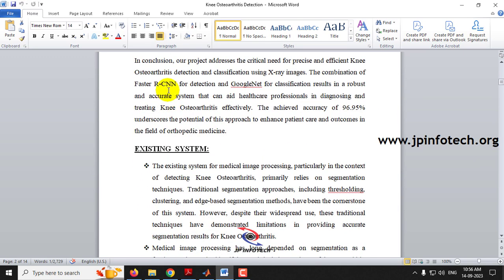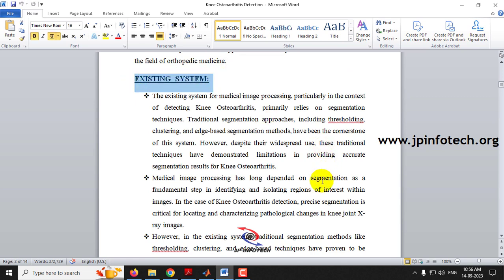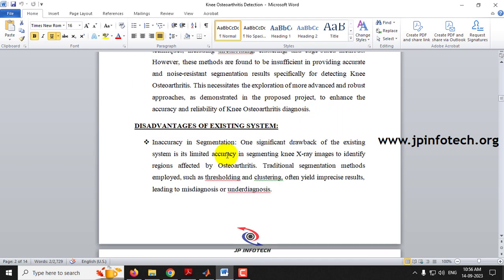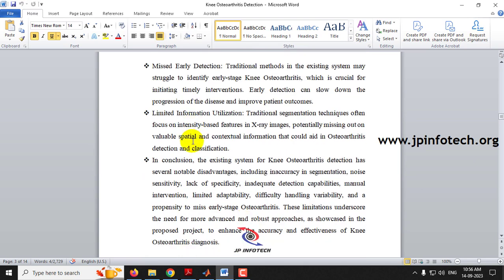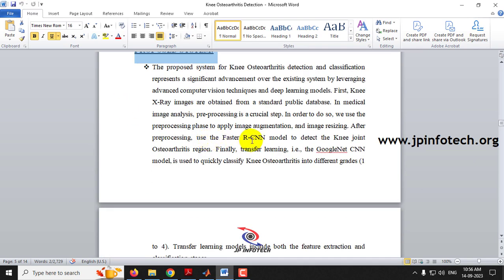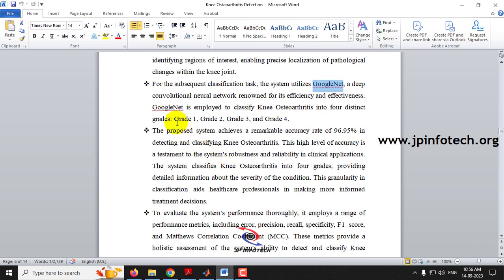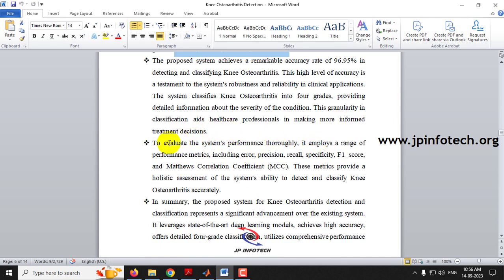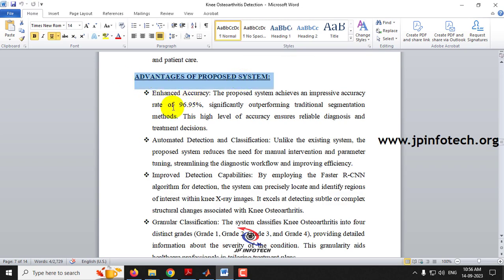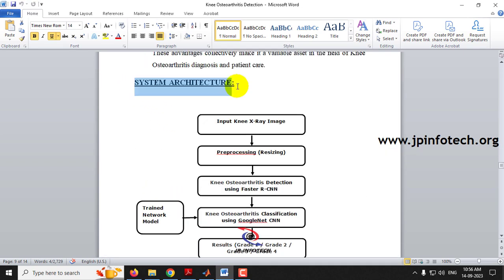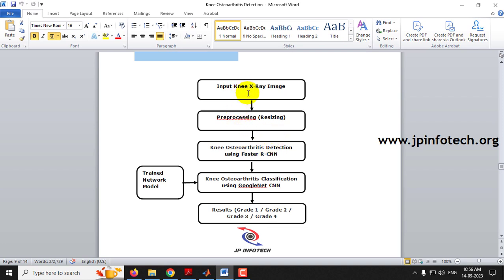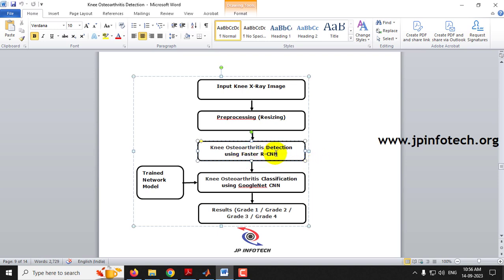That is about the abstract of our project. In the existing system, we considered various image processing techniques, and the disadvantages of the existing system are mentioned. In the proposed system, we have developed a model with both Faster RCNN, which is a region-based convolutional neural network, and GoogleNet, which classifies into grade 1, grade 2, grade 3, and grade 4. The system architecture takes a knee X-ray image as input, performs pre-processing, then knee osteoarthritis detection using Faster RCNN, followed by classification using GoogleNet CNN, and the grades are displayed.